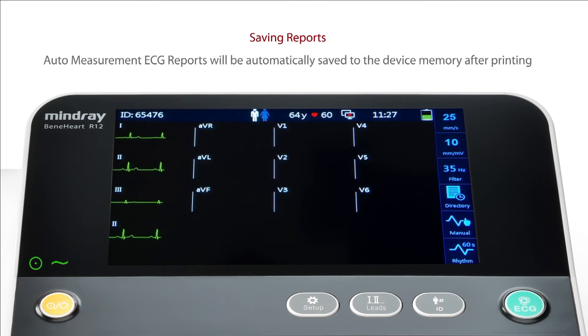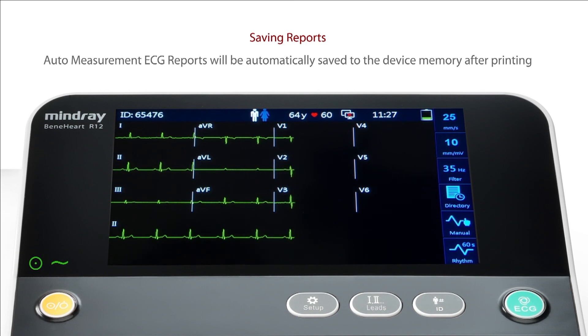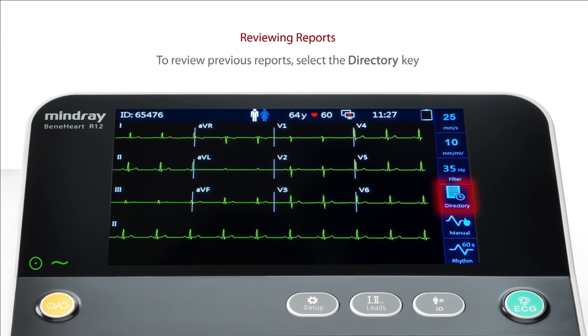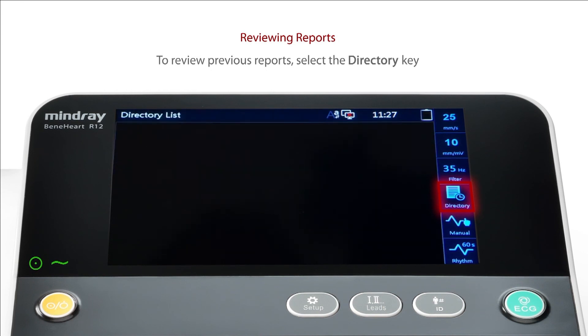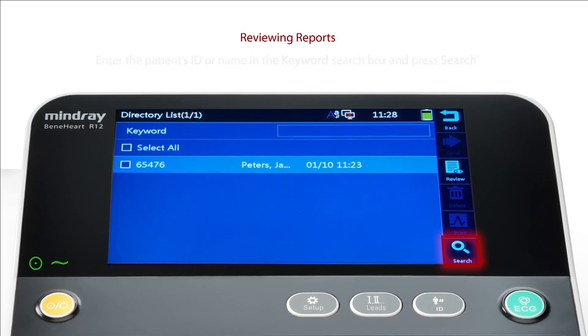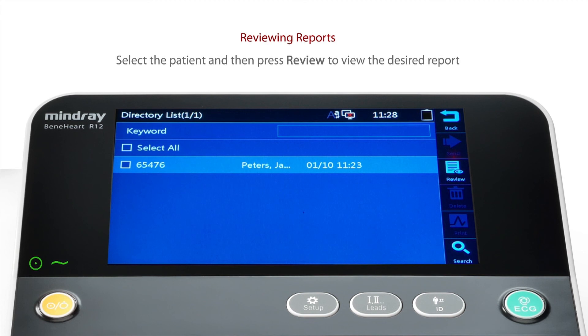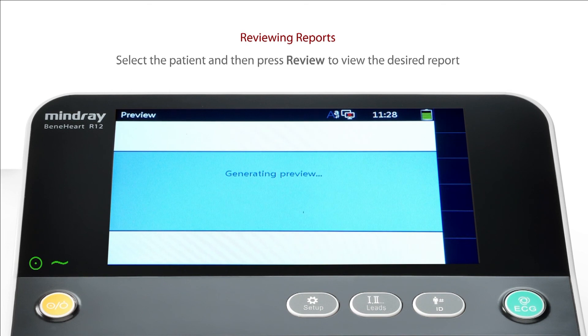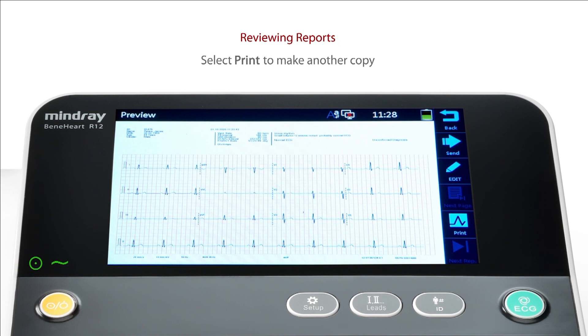Auto-measurement ECG reports will be automatically saved to the device memory after printing. To review previous reports, select the directory key as shown. Enter the patient's ID or name in the keyword search box and press Search. Select the patient and press Review to view the desired report. Select Print to make another copy.